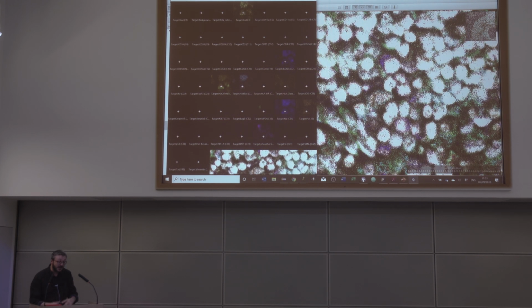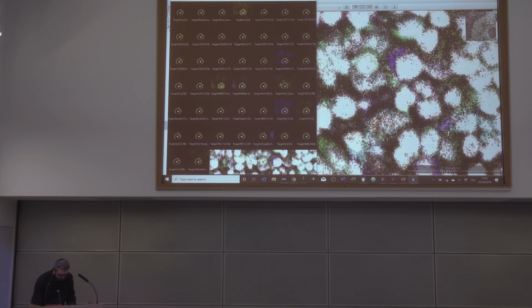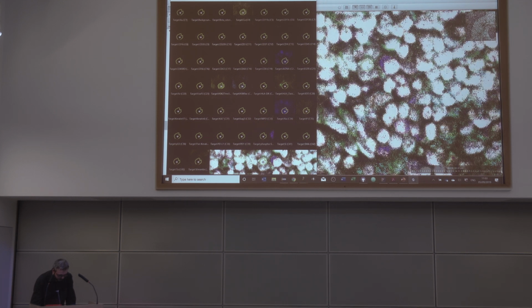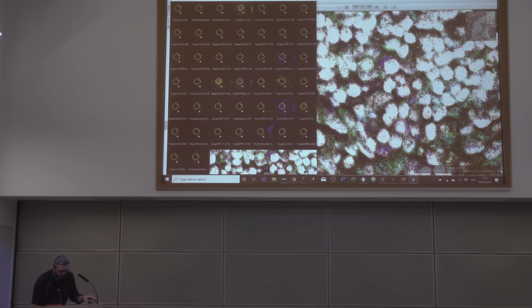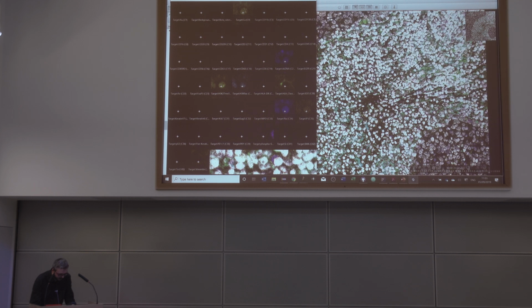and you can adjust, if you want to, the magnification. And so if you want to come up with your fantastic, more accurate cell segmentation method, then this might be of help to you, because if you need to create ground truth, you have, for example, the magic wand tools, all that kind of stuff. But you can then visualize, as you annotate, all of the channels simultaneously, and you can know really what has been detected.